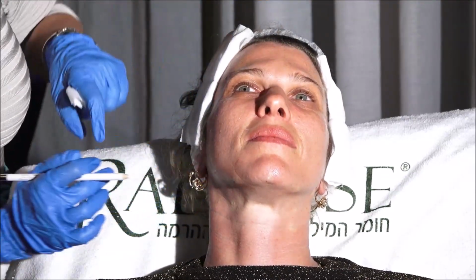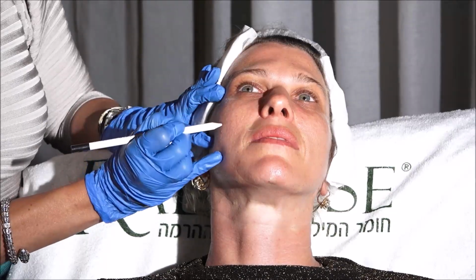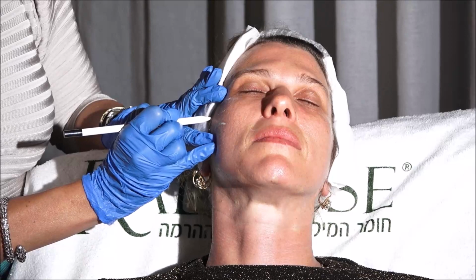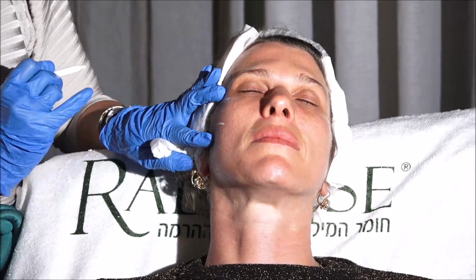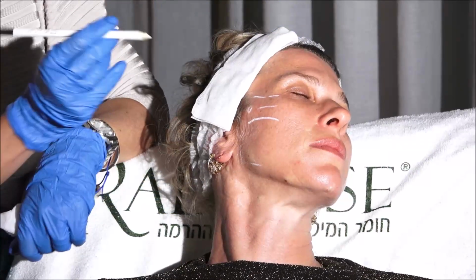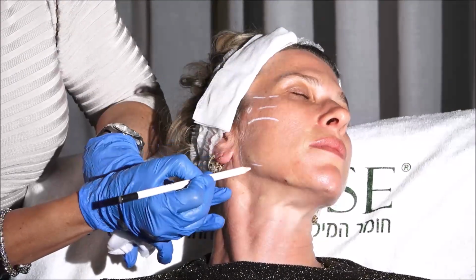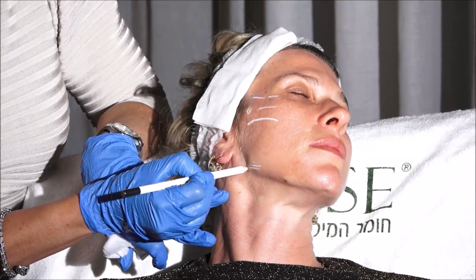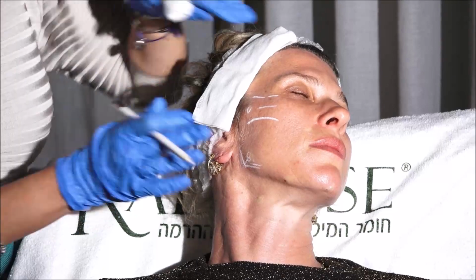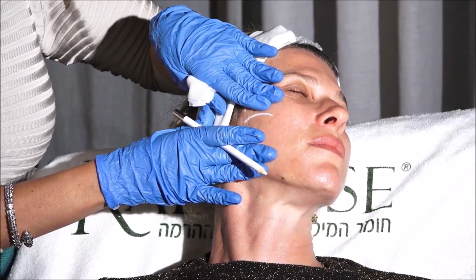So I already numbed the points of entrance. I just want to show where they are. Zygomatic, middle of the zygomatic, 1 centimeter in front of the hairline. This is where I put my point of entrance for biostimulation of the face. Angle, 1 centimeter diagonal, second point of entrance. For this, I treat the lateral face with Radiesse subdermal.